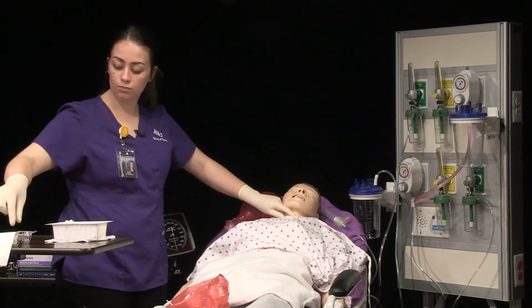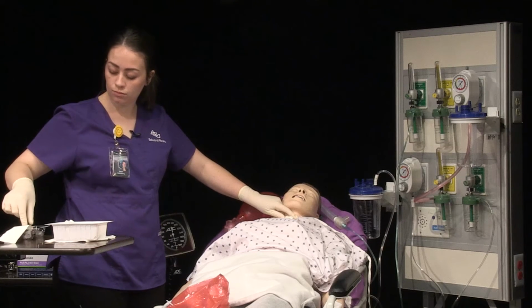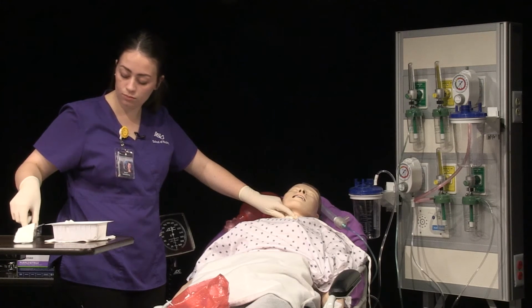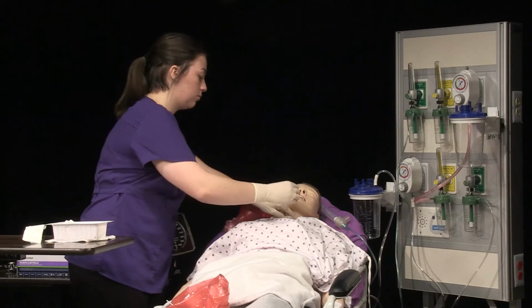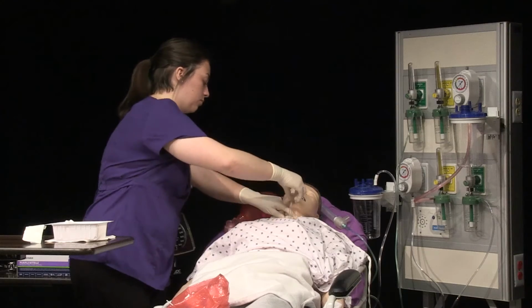Insert new inner cannula. Use dominant hand to position inner cannula properly over tracheostomy. Twist inner cannula to lock into place.